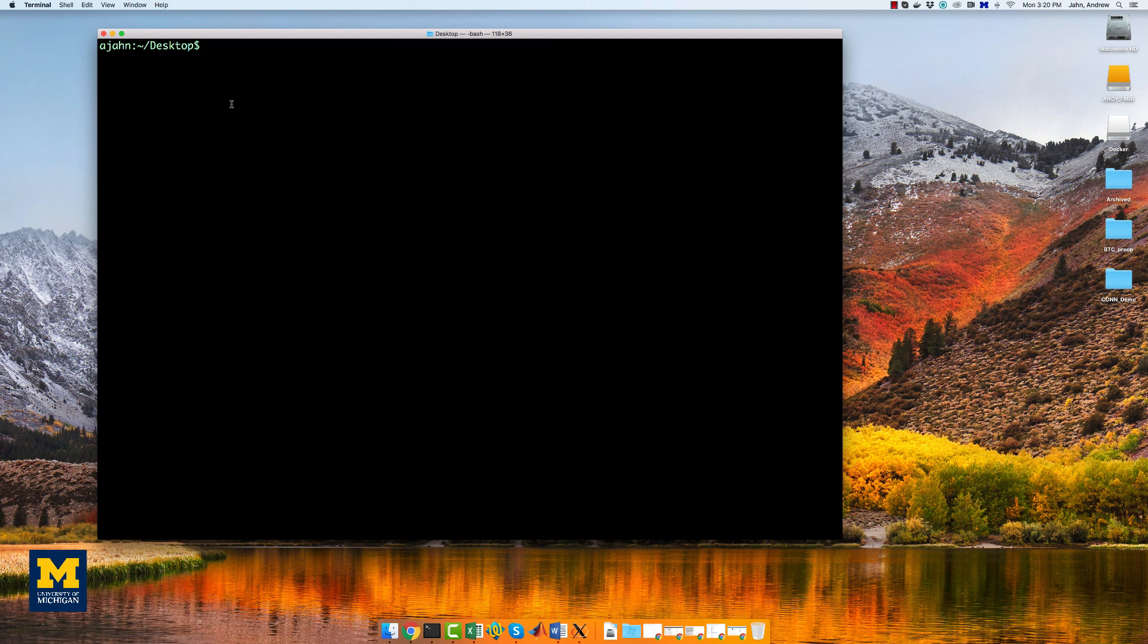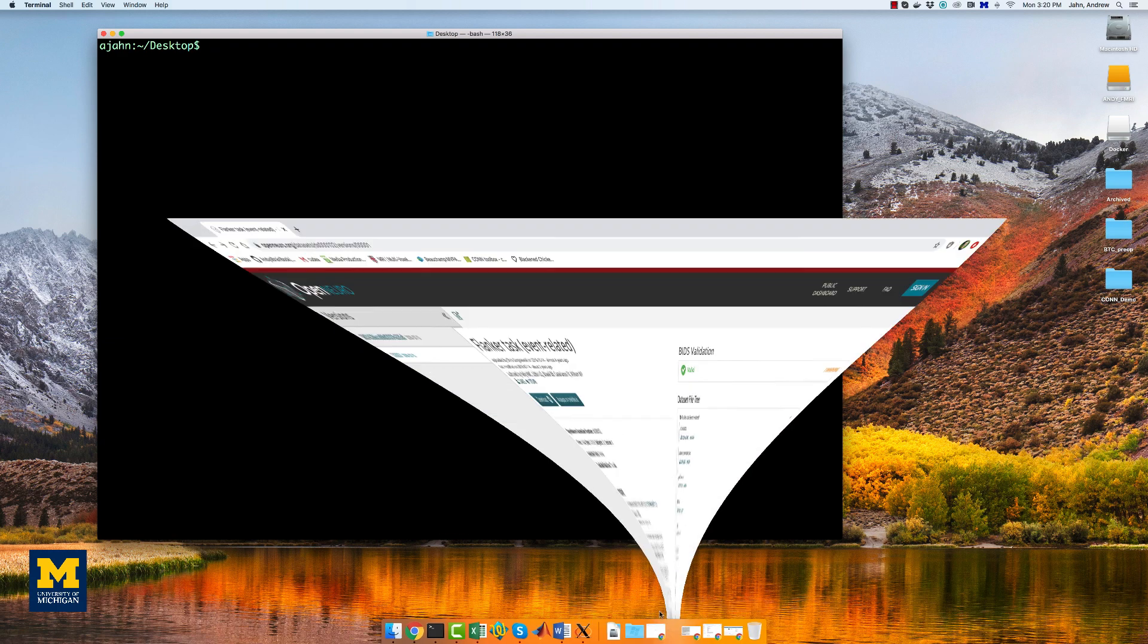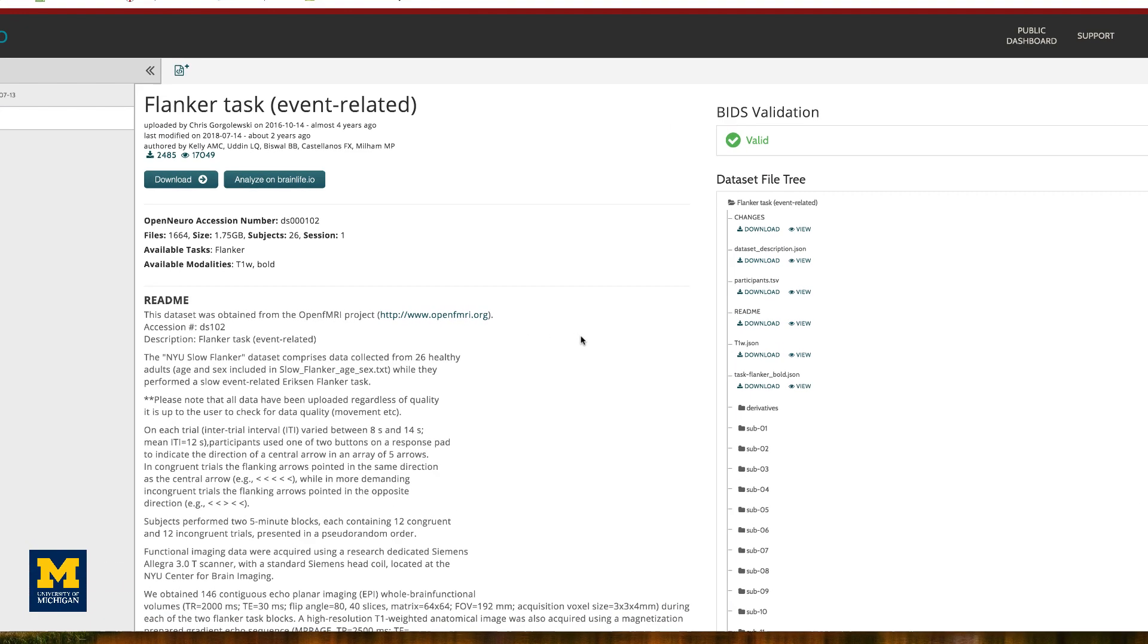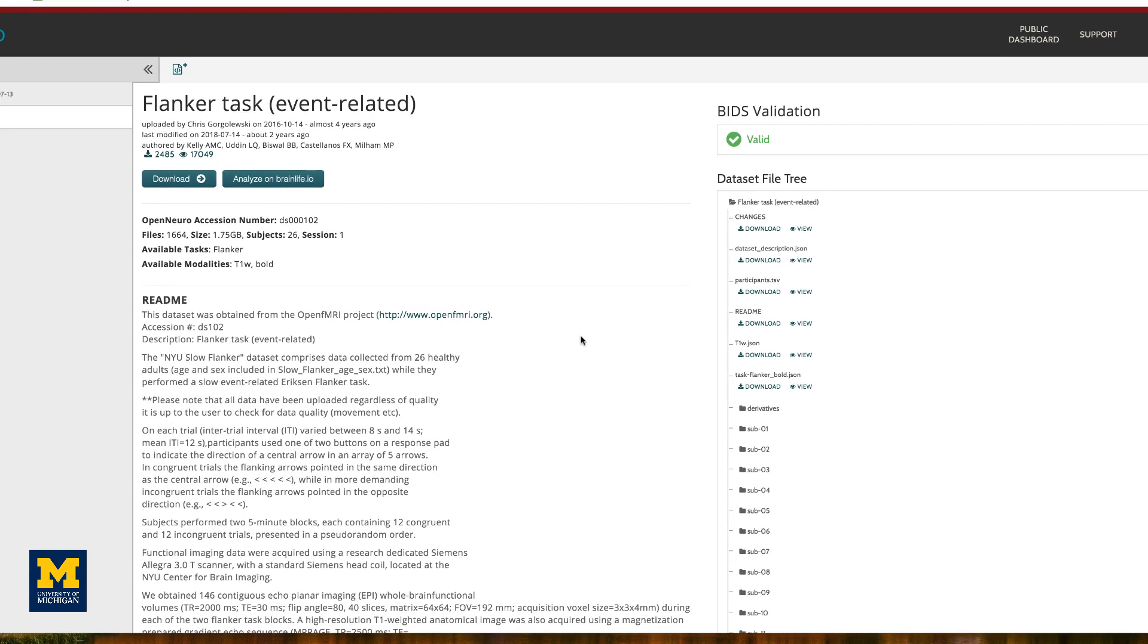Now that we have all of the prerequisites installed, we need a data set. For this course, we will be analyzing an fMRI data set that used the Flanker task, the same one that we used for the AFNI tutorial, so that we can compare the results.